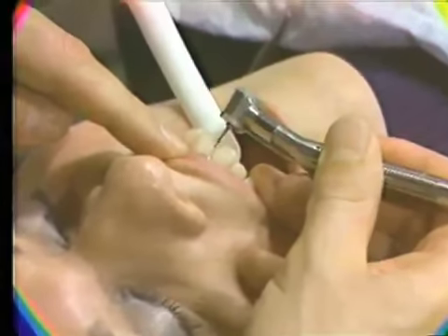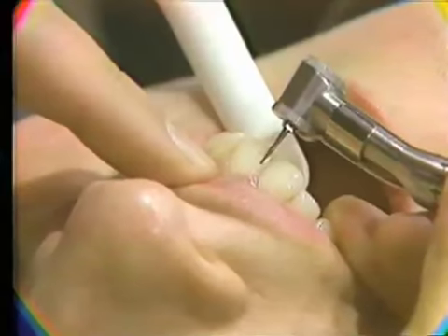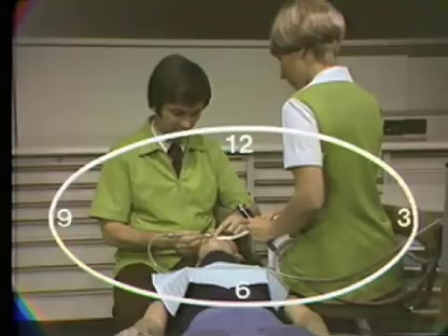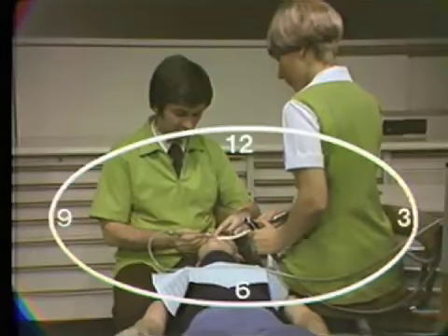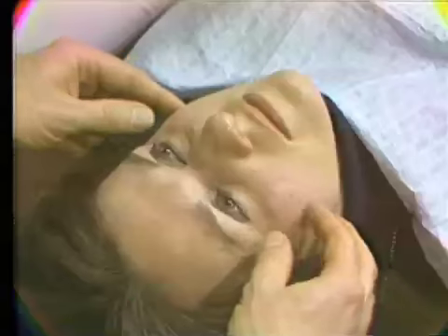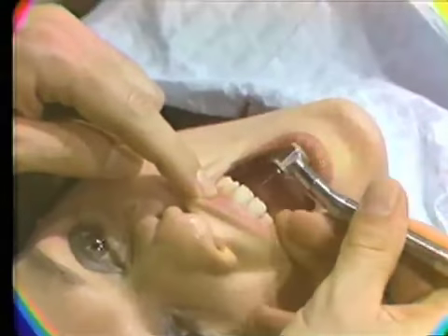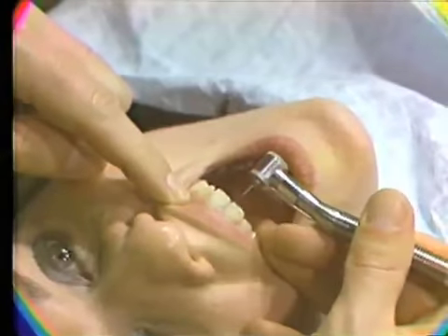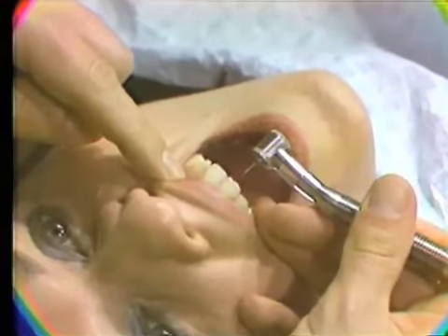Both direct or indirect vision can be used interchangeably as needed depending on the task to be performed. Generally, the operator has convenient access to the operative field from the 11 o'clock position while the patient is supine. Refinements in achieving access can be obtained by having the patient elevate the chin and turn toward the operator as needed. The upper lip is retracted with the operator's left index finger. Again, finger rests are established on either the incisal edges of the adjacent anterior teeth or the occlusal surfaces of the maxillary right bicuspid teeth.